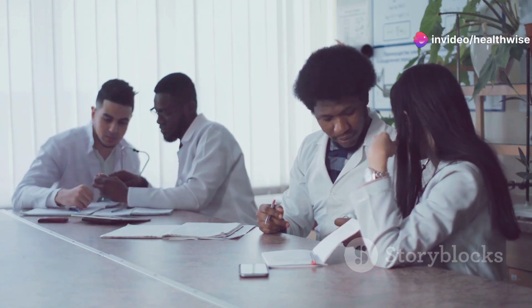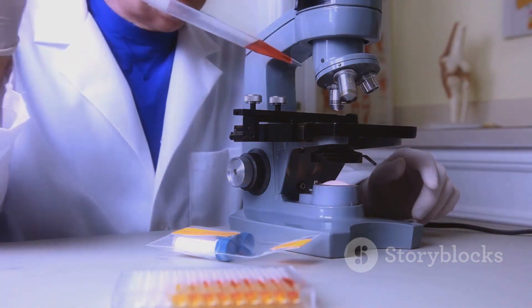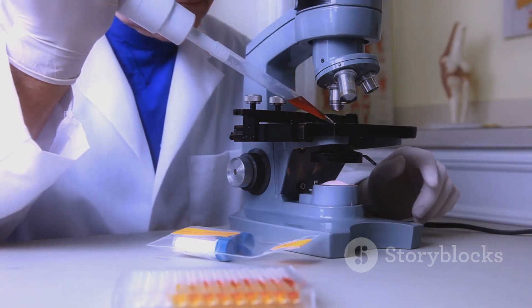First things first, when you collect a CSF specimen, you need to carry out the cell count as soon as possible. Why? Because the cells can rapidly lyse, making it harder to get an accurate count.